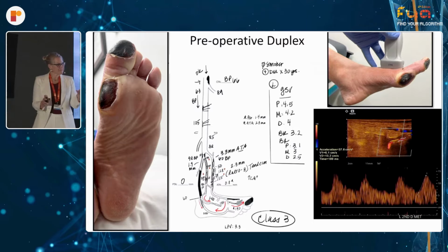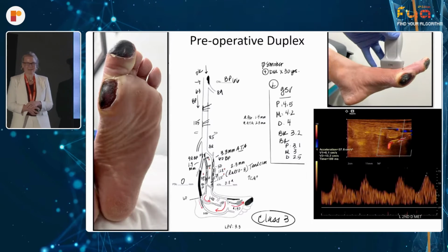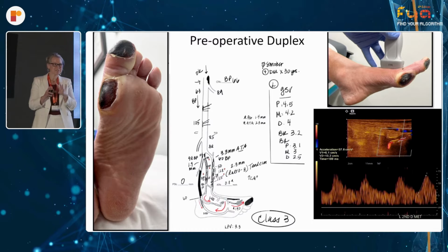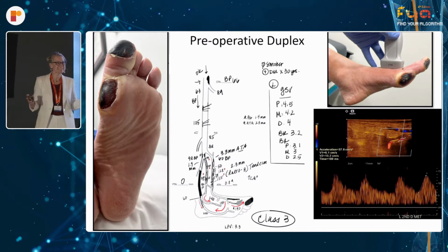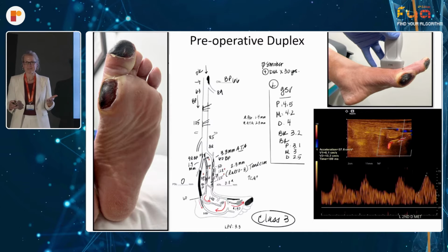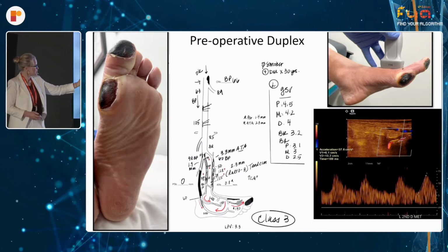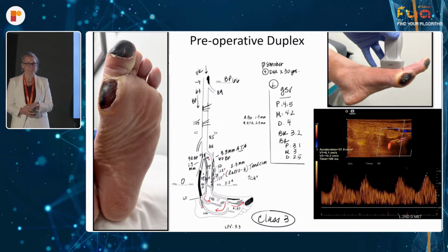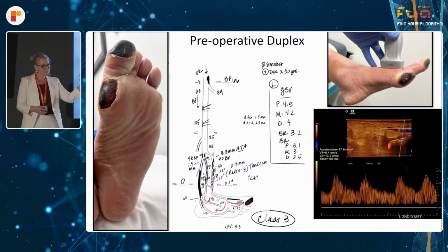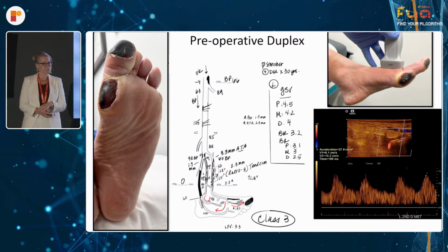And I can't hold back, Lorenzo. I have to add in just a little bit of the preoperative ultrasound because this gives you a target artery pathway, basically an ultrasound roadmap. We used to stop scanning at the level of the ankle, and who wouldn't want to know what's happening in the pedal arch? Because in this situation, his first dorsal metatarsal artery is occluded, and we're just going to have to get flow through the second dorsal metatarsal artery going to that great toe wound.